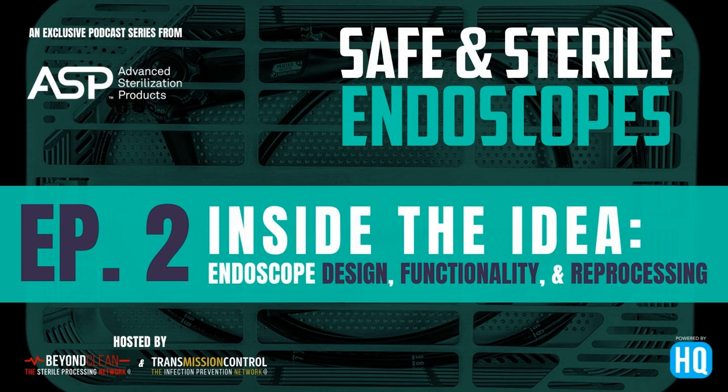Tamara, what else would you say is left out there to do? Just wrapping it up from a clinical and an educational perspective, we know that there are so many different standards and guidelines, recommendations, what's required, what's recommended. And then we've got the additional TIRs that are coming out that are looking at water quality, monitoring bioburden. What is that going to look like? So now we're adding 2 more things to think about. I'm going to check how my cleaning was done, and then I'm going to check how's my water that I'm doing my cleaning in.